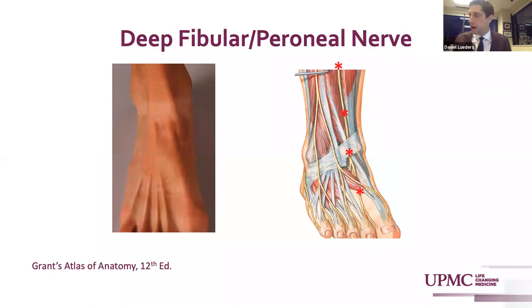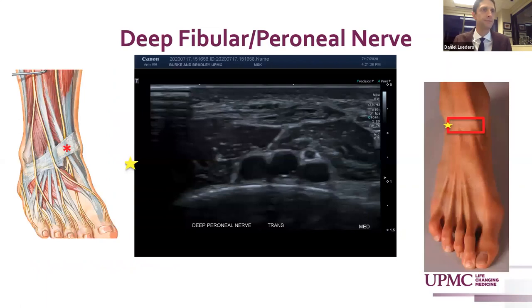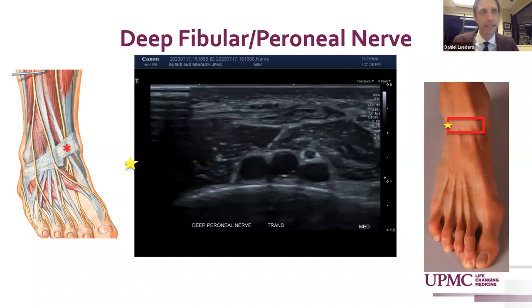Moving on to the neurologic structures of the anterior foot, the deep fibular nerve courses through the anterior compartment of the leg and crosses over the anterior ankle joint and courses into the first web space. One prominent landmark to confirm the location of the deep fibular nerve is the anterior tibial artery, which lies in a deep position against the anterior tibia, shown here as a hypoechoic circular structure with a lumen. It sits just lateral to the extensor hallucis longus tendon and muscle, and its anechoic appearance and pulsatility on Doppler will confirm its location.